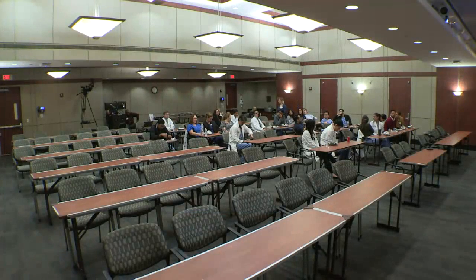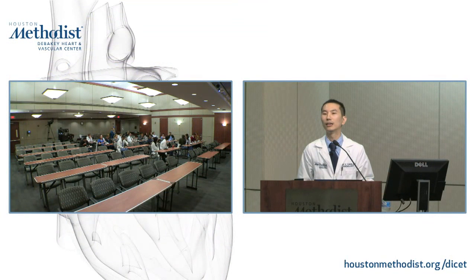Yes, Peter. This is more of a basic question. How long is the breath hold for these CMRs? We get CMR consults, and I know they have to hold their breath, but I don't know how long they have to hold their breath. So for the regular parts like the cines and delayed enhancements, the single shots, they don't need to do breath holds. Usually the techs know to try to optimize it between 5 to 10 seconds. Sometimes our phase contrast flows may go up to 10, 15 seconds, but we try to avoid that. For the perfusion, we give them the instructions to try to hold out as long as possible, but if they tire out, they can breathe, but try to shallow breathe because we're trying to acquire about 100 cardiac cycles or so.